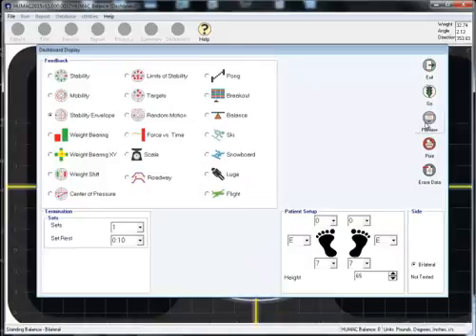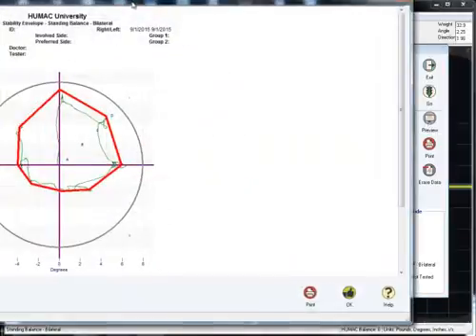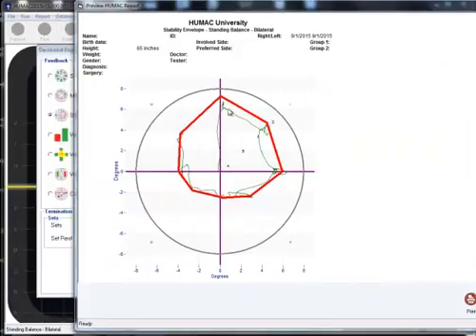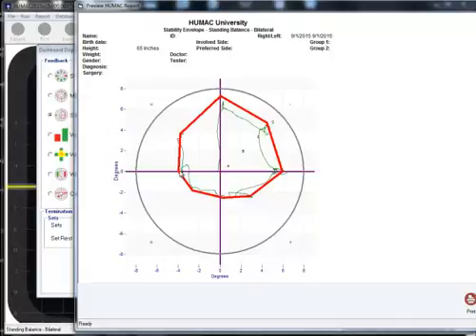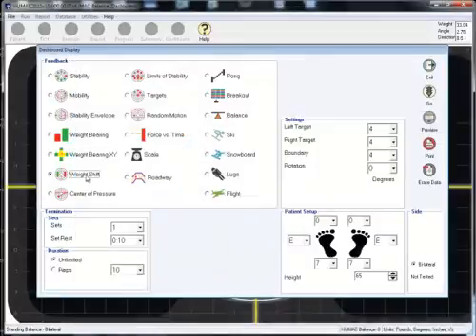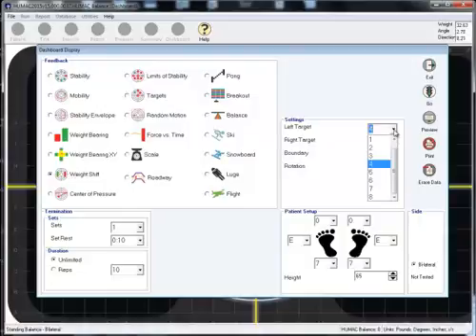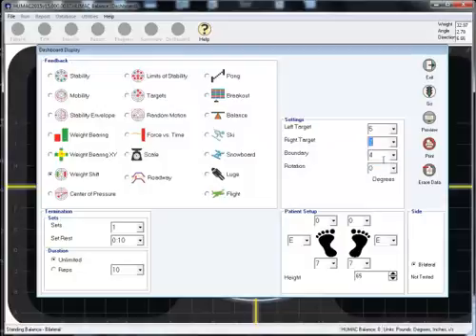In the test we just did, you will notice the patient is able to lean forward and to the right just fine, but is having trouble leaning to the left. They are able to go 6 degrees to the right and only 4 degrees to the left. With this information, you might build a training display using Weight Shift, which will extend the left target, but bring in the right target since the patient doesn't have a deficit leaning to the right.